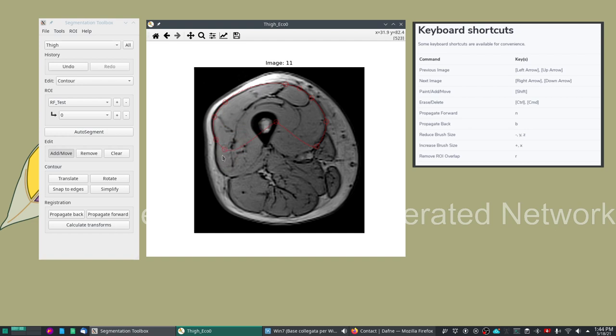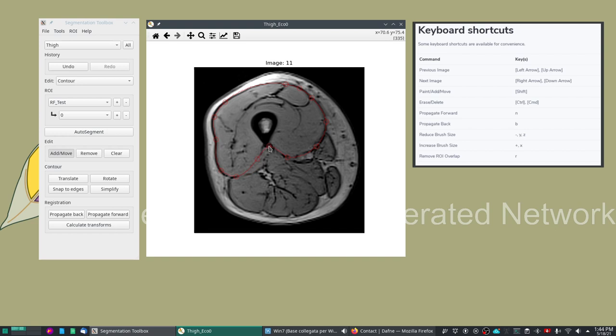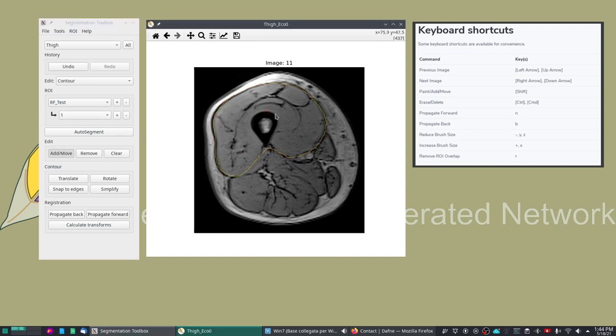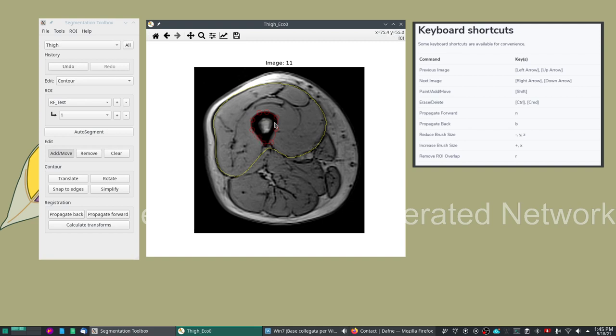Let's imagine this is the quadriceps. We want to exclude the bone from this ROI. So we can create another so-called sub-ROI that is around the bone. When we export this mask the actual mask that will be generated is the exclusion or XOR between these two contours.